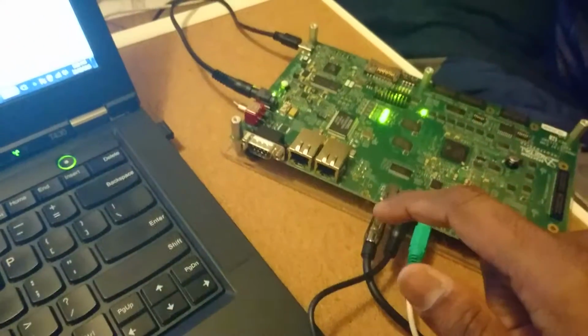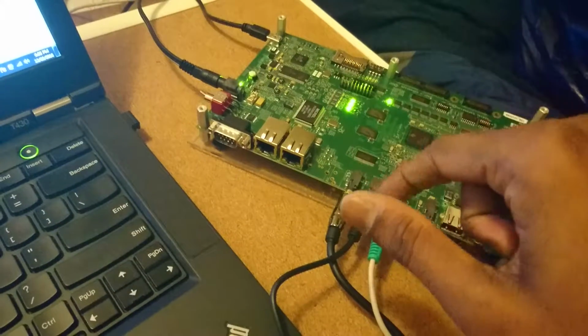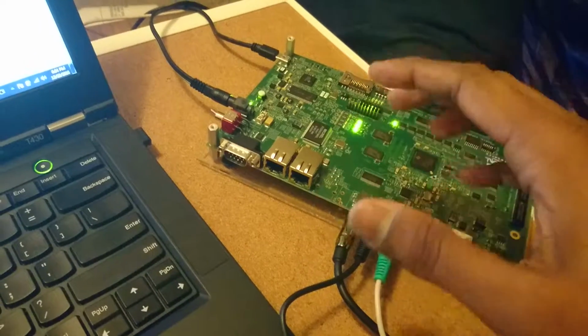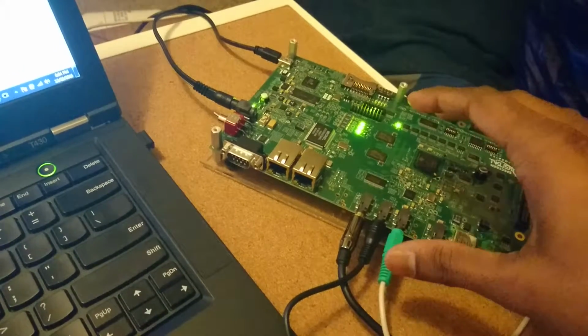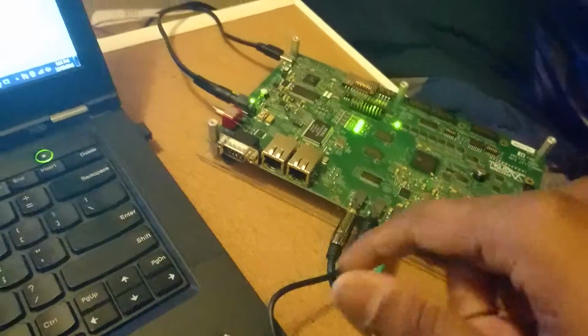But definitely as a future enhancement, before applying the LMS algorithm, we can amplify that signal before we even apply the algorithm. So for now I'm able to get the two signals parallelly through to the DSP, and also perform the necessary manipulation in order to get them out on the headphone out. So now I'm going to debug the code. Now the debug mode is running.